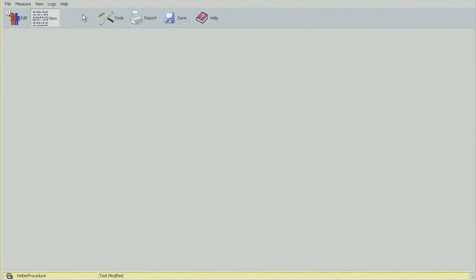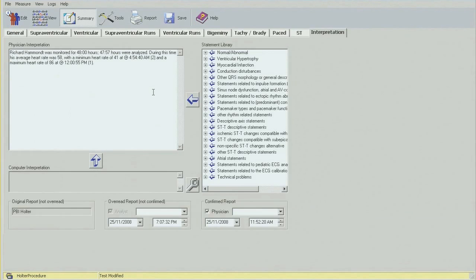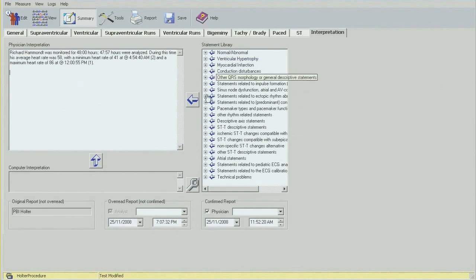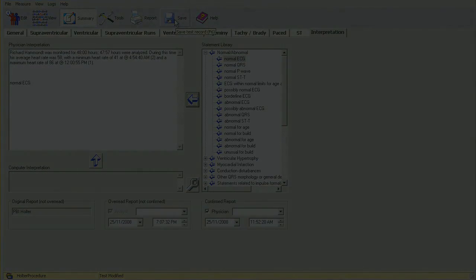The next step is to go into Summary. This is where we fill out the information in the interpretation field — it tells you how long the patient was monitored and the minimum and maximum heart rates we selected. You can type your own interpretation or use any of the phrases from the menu on the side, such as 'normal ECG' and so on. At this point the study is done — just save the report.